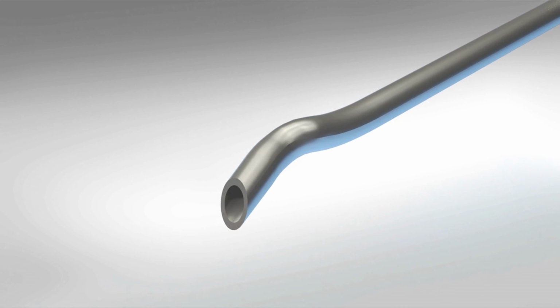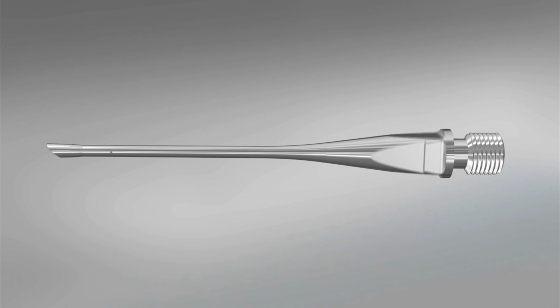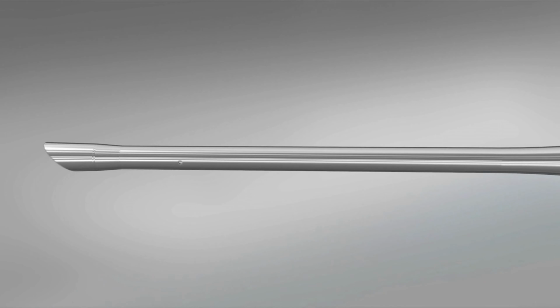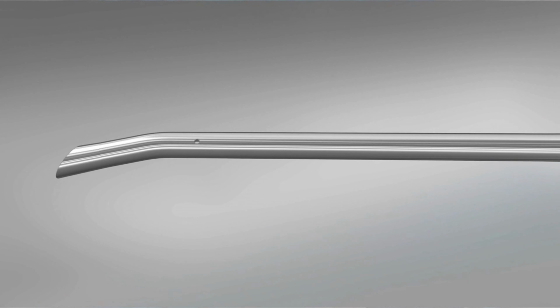So what we did, and you need to know, is ultrasound started for example, for 100, the 60 became that 100. So if you're used to a machine like Infinity and you're changing to Centurion, it's very important for you to start lowering the ultrasound, because this ultrasound with this phaco tip is more efficient.